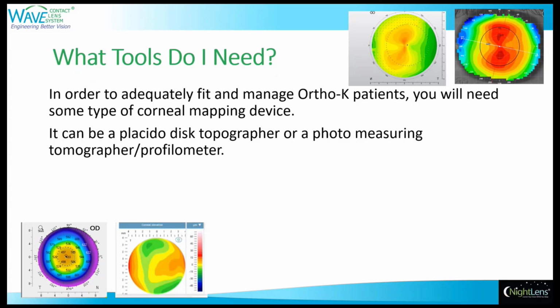It actually takes a photo measurement of a large surface of the eye itself. So if you're thinking about including scleral lenses or have offered scleral lenses or other specialty type contacts into your practice, the tomographer and profilometer will measure a much larger area than the Placido disc topographers.